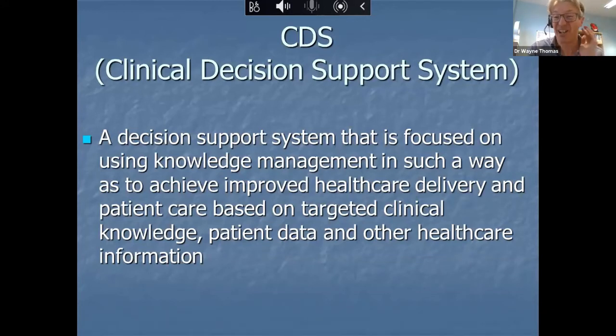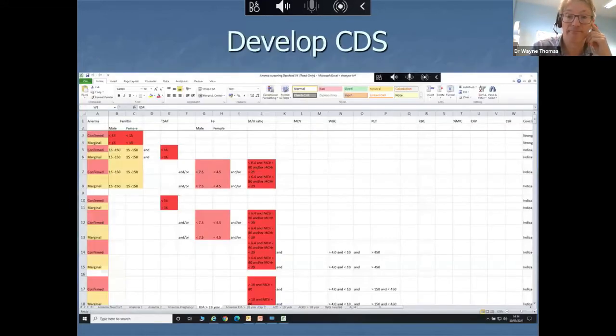So that I see as the future development of all of our hematology analyzers, not just doing scans of blood films so that all of those cells are being looked at, but also using the raw data that comes off the blood count combined with the chemistry results to create an overall picture that you then feed into algorithm-based clinical decision software.